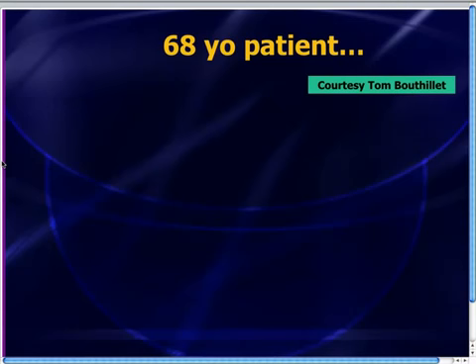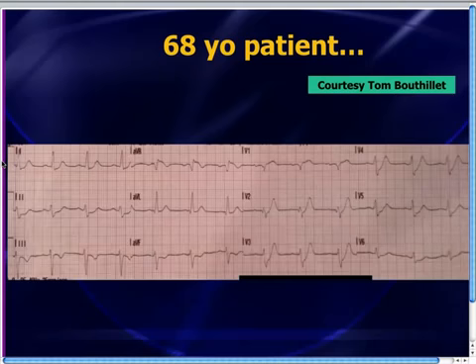It gives us an opportunity to talk about something that we haven't talked about before, but it's definitely worth talking about, and I think you're going to start seeing this more and more in the literature, probably in the next coming years. So Tom had a 68-year-old patient, man or woman, I'm not really sure, but it doesn't really matter. 68-year-old patient who came in with some chest pain and a clearly abnormal EKG.